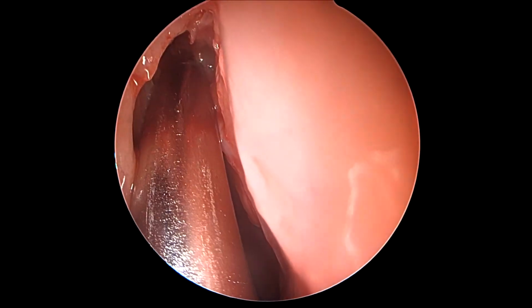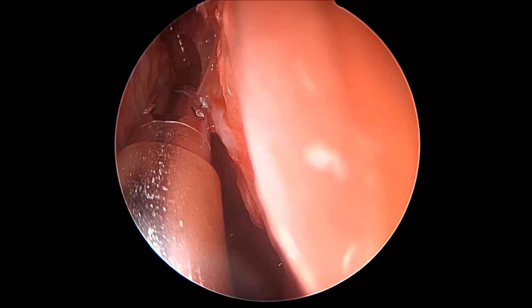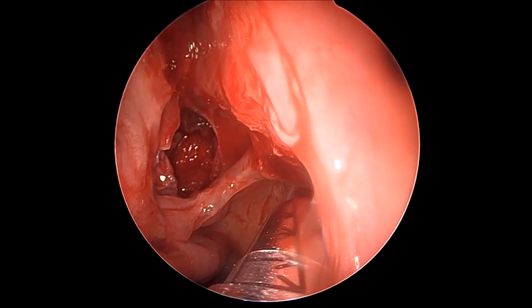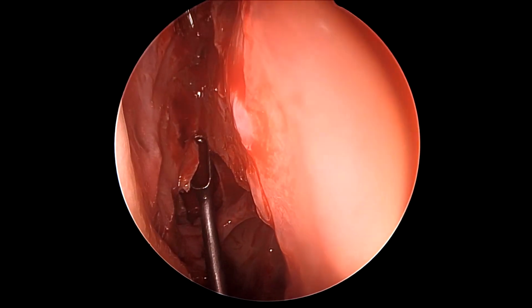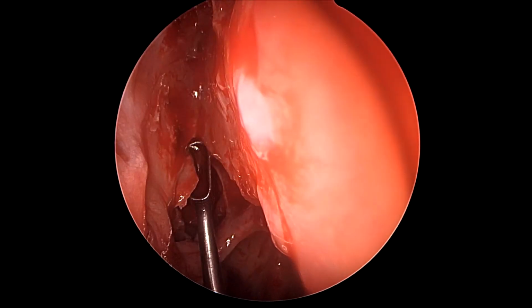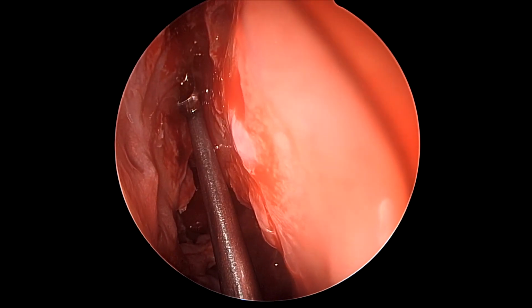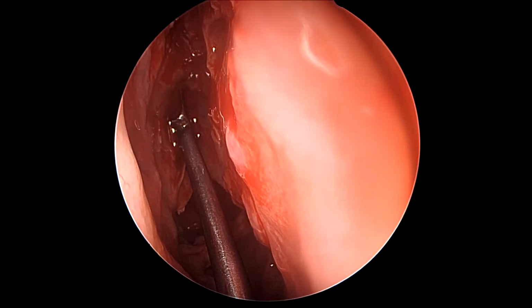One must be mindful, however, laterally of the lamina papyracea, because when using powered instruments, one must always be cautious of the face of the microdebrider. It must always be under vision so that it does not injure the superior portion of the lamina papyracea. That can lead to inadvertent orbital trauma, as well as protrusion of orbital fat inside the frontal recess, which is sure to cause disruption of the work inside the frontal recess, as well as possible stenosis of the area.